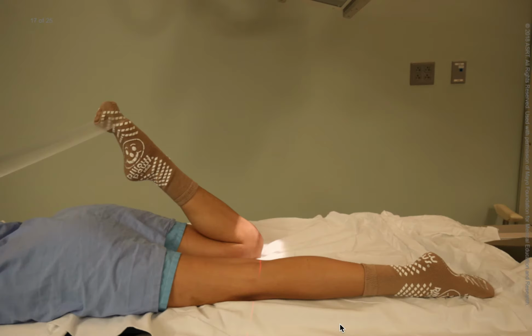If acute flexion is not contraindicated, slowly flex the affected knee until the patella is positioned perpendicular to the plane of the image receptor. In the prone position, the patient can use a long strap or bandage looped around the ankle to hold the leg in place. Using slow, smooth movements to position the knee will help the patient tolerate the exam.